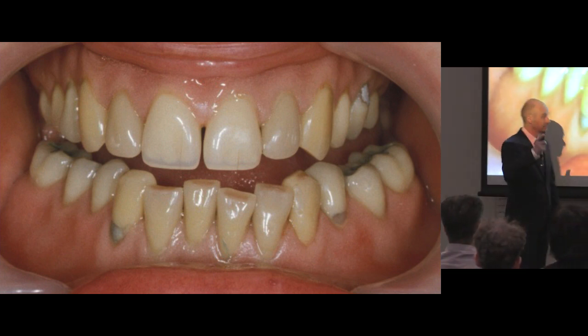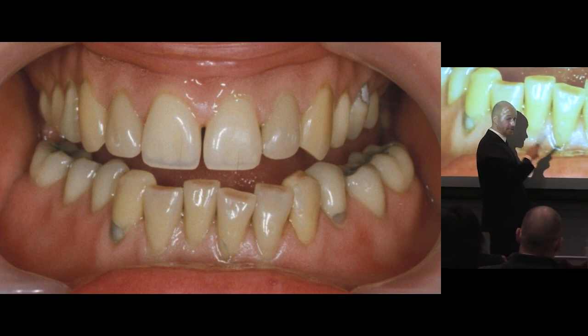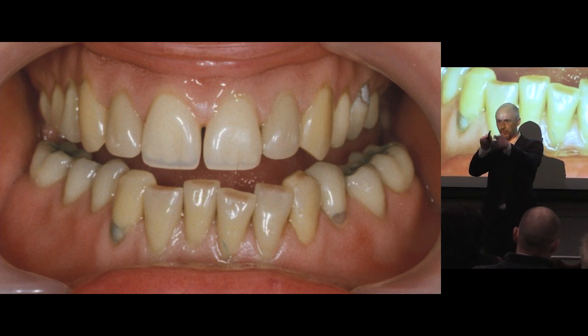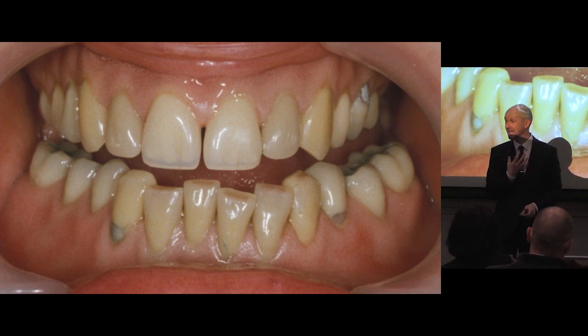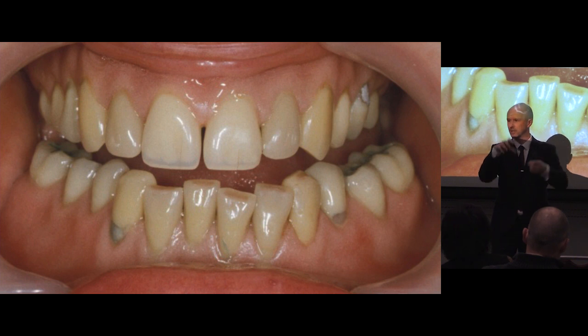Matt, we were talking about characterising teeth. So let's talk about the wear on these. What Dr. B will have done here is drill that out with a round, like a rosehead burr, a small one, and made an undercut in it, and then put in a dark composite. The composite I use is HFO, but I think you can get all different types with these dark colours, like GC composites, etc. So it's like a brown stained composite, thick.